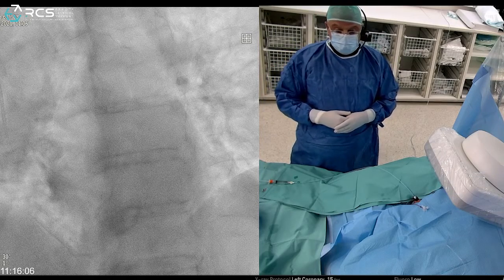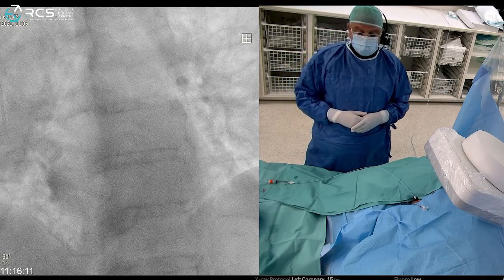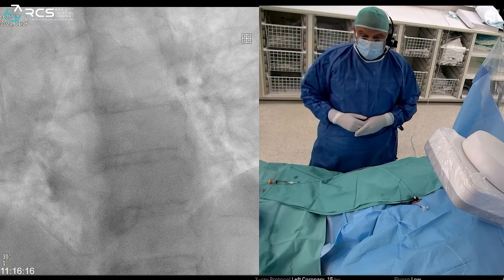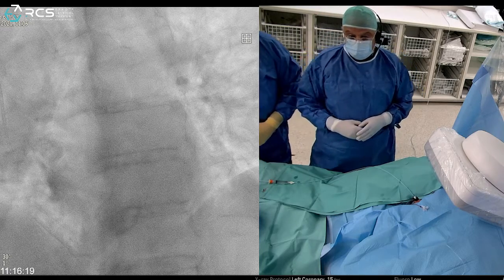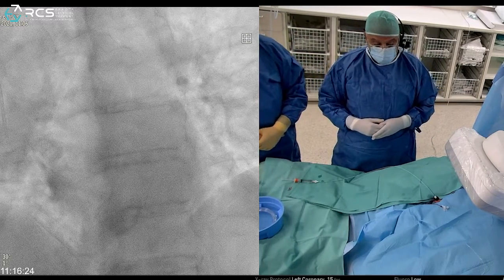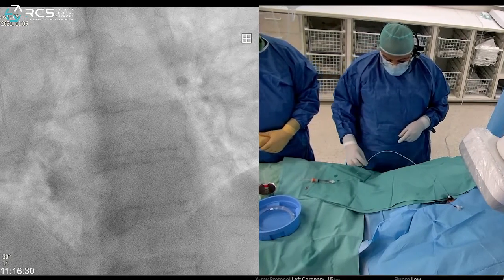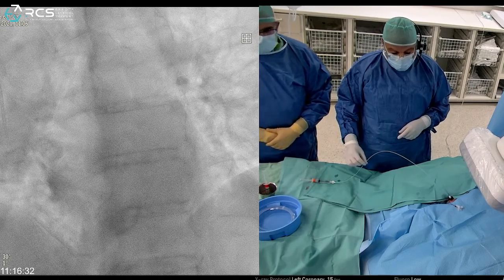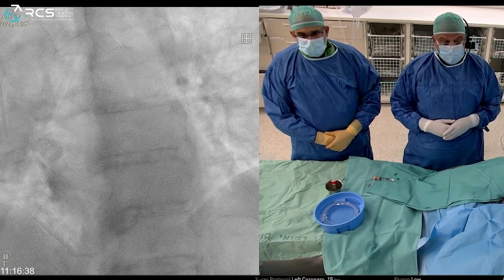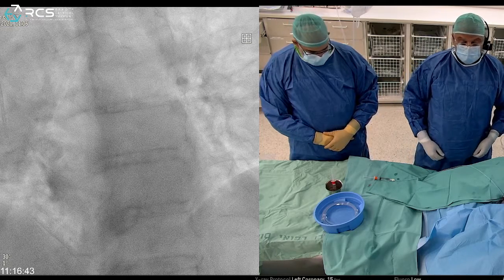Hello, we are going to video today a case of coronary sinus reducer implantation. After puncturing the right jugular vein with a nine French sheath using ultrasound-guided puncture, we took a six French diagnostic multi-purpose catheter, went into the right atrium, and measured mean pressure. Mean pressure was 11, so we can proceed with the procedure.